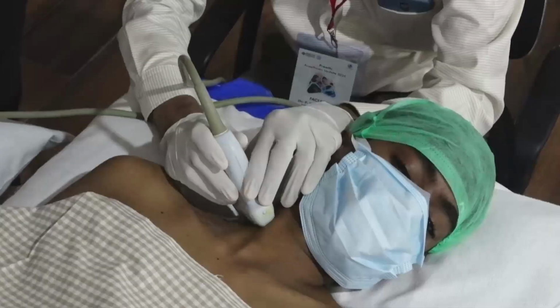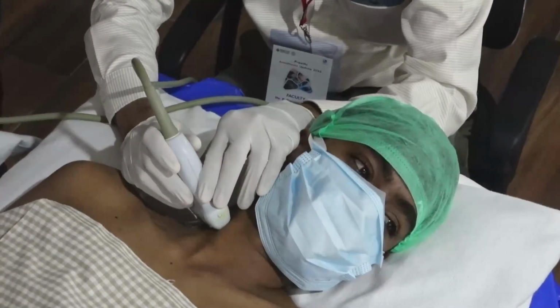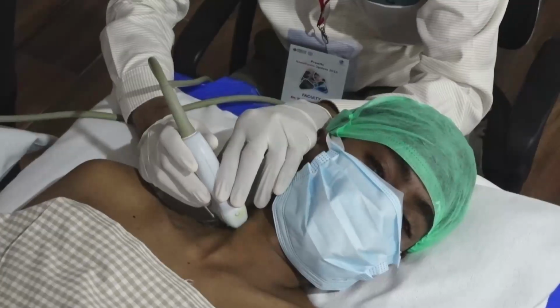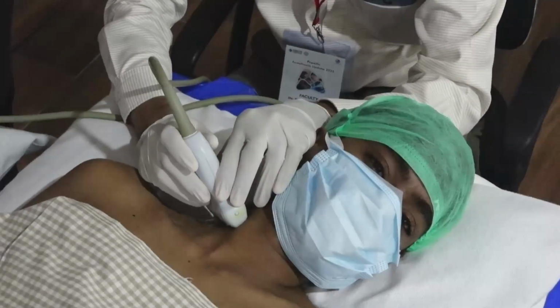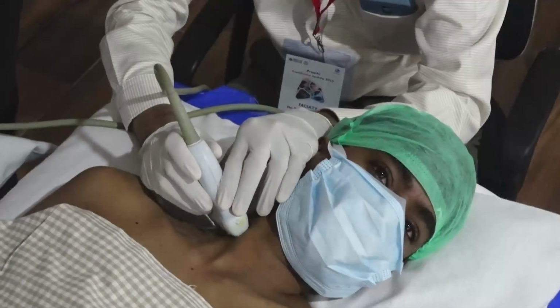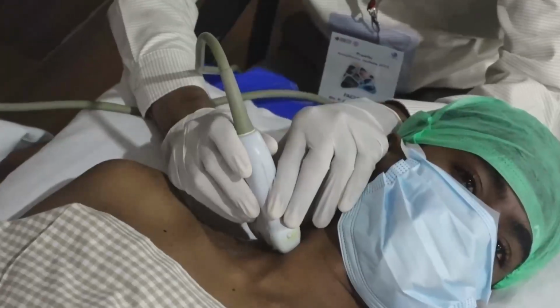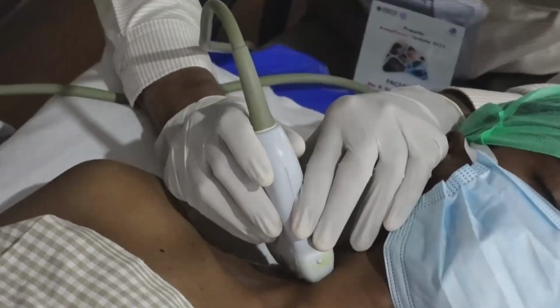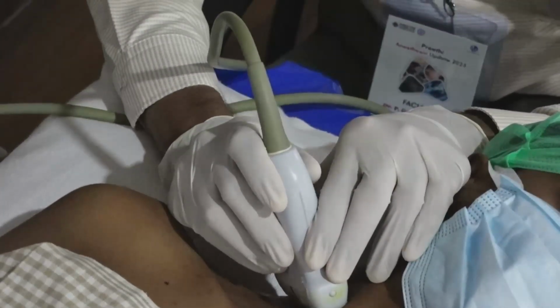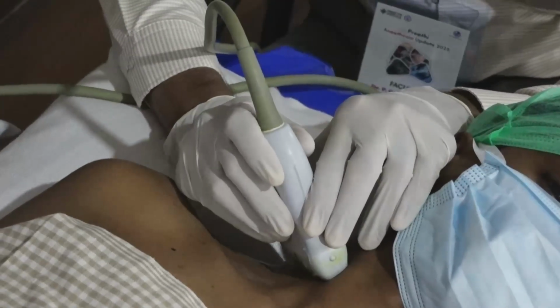Next to that, medially, that prominent tubercle is the C6 anterior tubercle. Relatively, the posterior tubercle is smaller. Now we found C6. C6 divides the moment it comes out. Here also, we have to note the division.